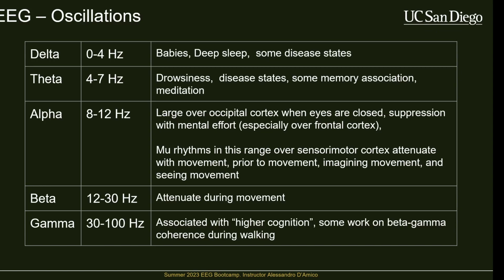You record your EEG, you can take these large time scales and compute a Fourier transform to get the power spectrum, and you can just associate that activity with all sorts of stuff. That's very bad experimental practice, but that doesn't stop people from doing it, which is sort of why this research is all over the place in a lot of different subfields. But there's a lot of nuance.